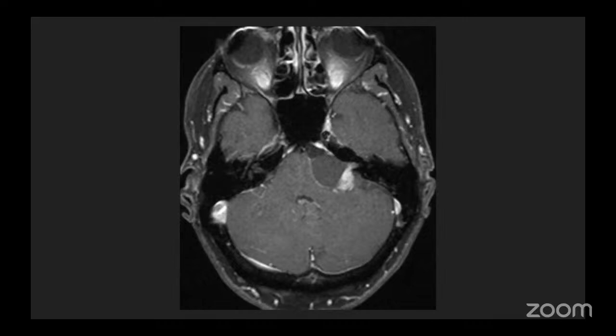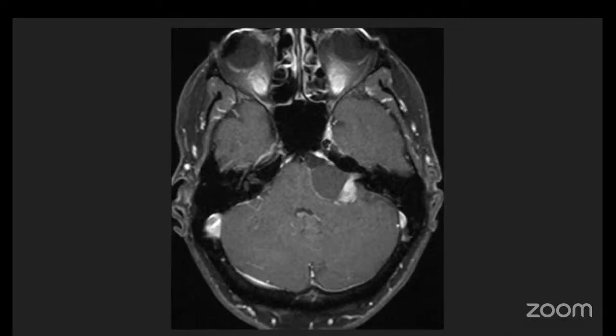So this is a cystic schwannoma. It's an MRI brain with contrast, axial image. What you are seeing here is a well-circumscribed lesion in the left CPA, which is showing heterogeneous intensity. You can see it arising, the origin is from the internal auditory canal on the left side.